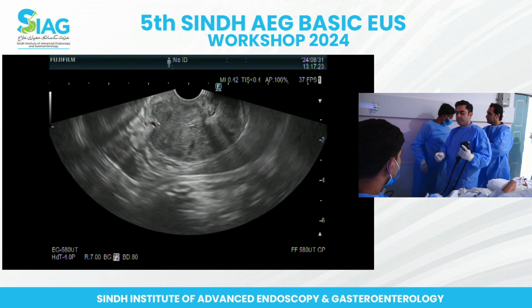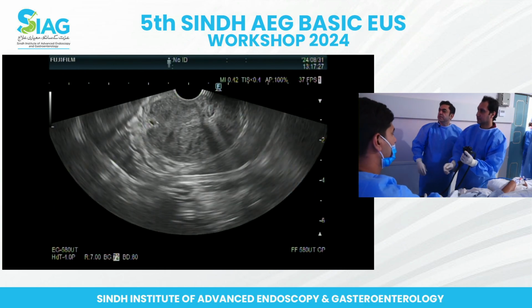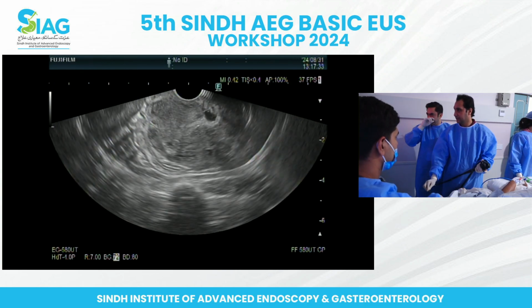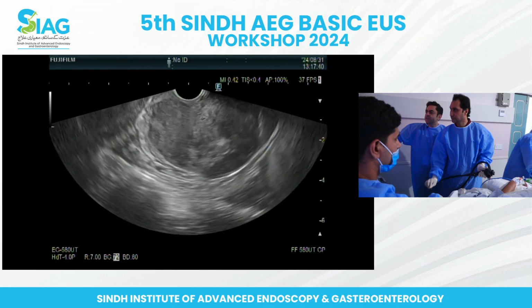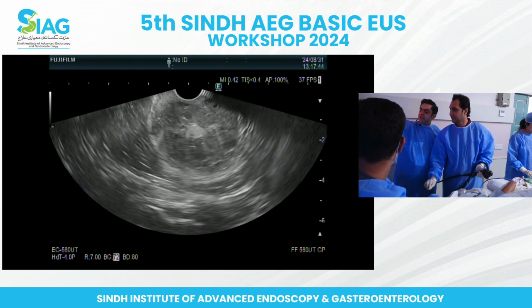Do you want to play around while he's getting the biopsy? Have you ever done a biopsy? I'll just hold it and let you feel the jab, how it feels. This is all soft tissue. So how will you describe this centrally?